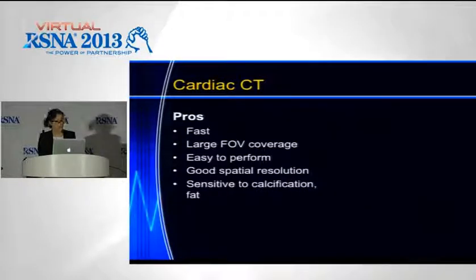So let's take a look now at cardiac CT. Everybody's aware of the pros of cardiac CT. It's very fast, it's readily available. It has that large field of view coverage that enables us to also assess the extracardiac structures. It has high spatial resolution and it's sensitive for calcification as well as fat, which is important in mass assessment.